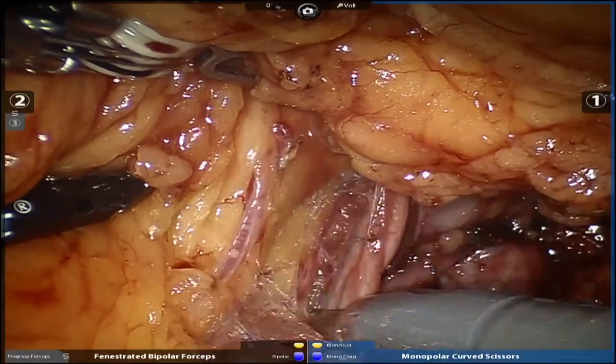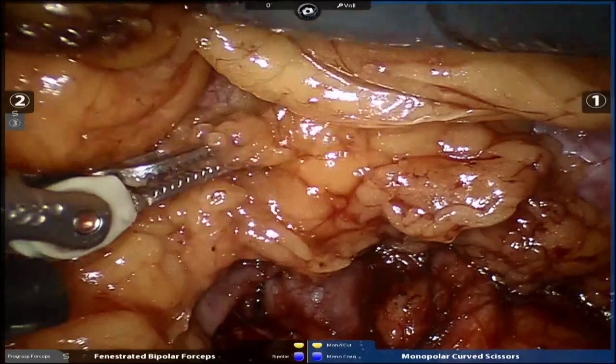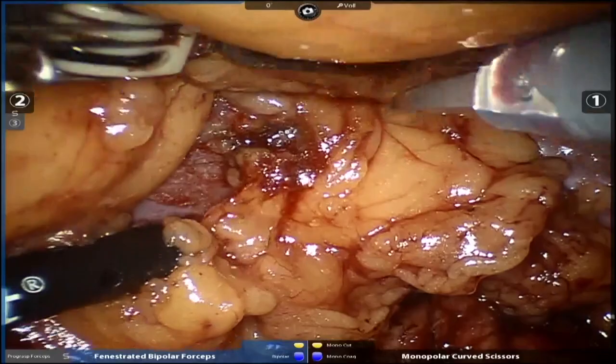Uh-huh, ureter. And you think, I'm not aware about the CT anymore, but do you think this could be a lower pole vessel? Or there is a lower pole vessel that we saw separately, which we're going to have to find. Yeah. So I'm just going to explore the lower pole now. Now I know where the ureter is. There's some very large veins involved here, and this is probably one of them right here.